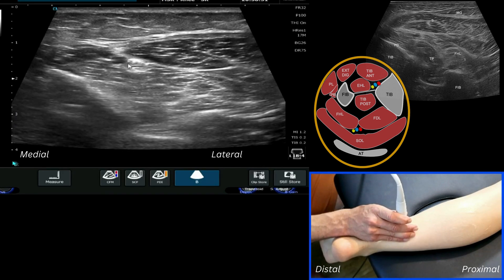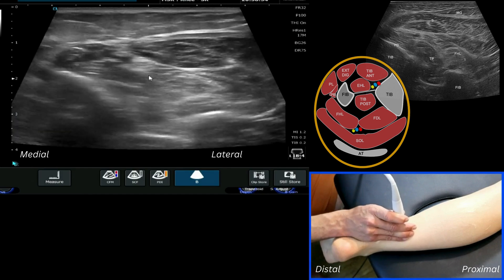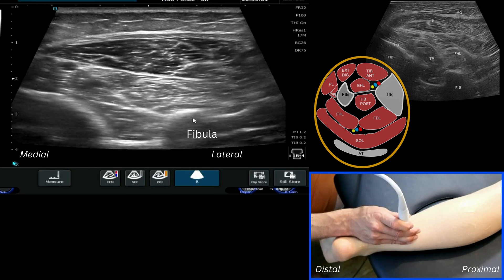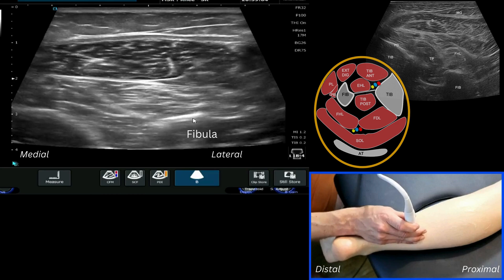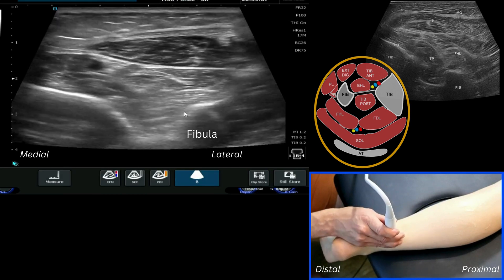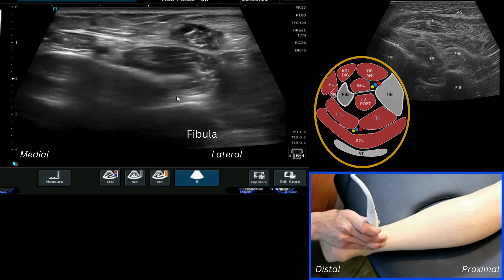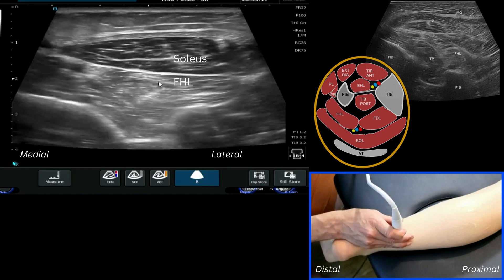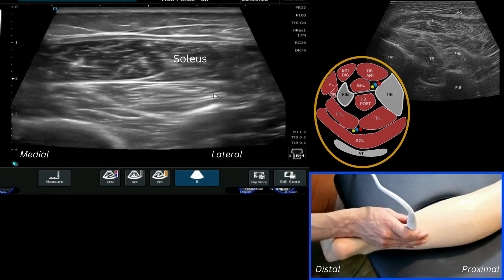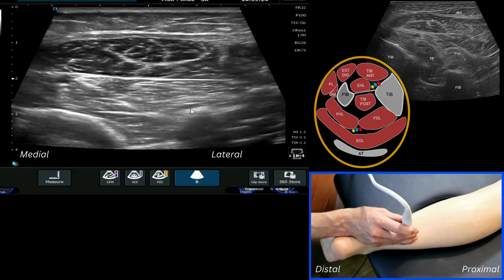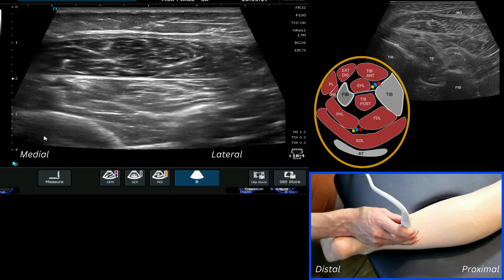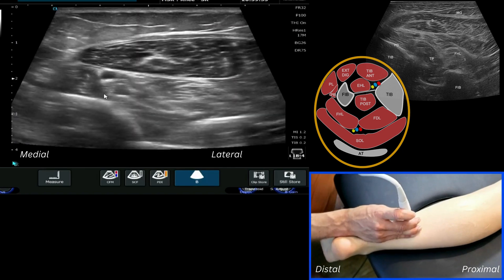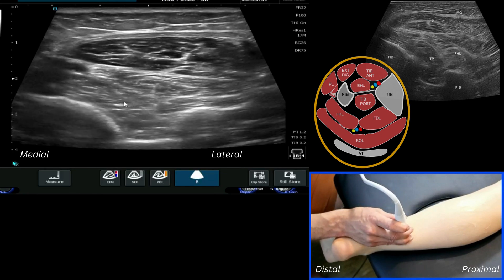We follow it up, we see digitorum go over the top, and we see tibialis posterior now merging into its muscle here, deep to the artery and the tibial nerve. If we come over a little bit more laterally, we start to see the outline of the fibula in the deep part of the image, and we can also see the FHL muscle — a large muscle sitting quite centrally underneath the soleus. Following its central tendon as it thins out, it starts to spread out and become quite a significant muscle in the posterior calf. At this point we have the tibia, the fibula, and FHL taking up the majority of that space with tibialis posterior adjacent to it.